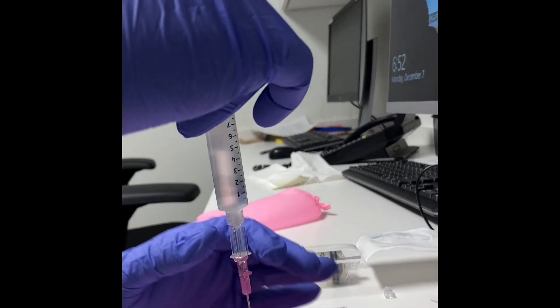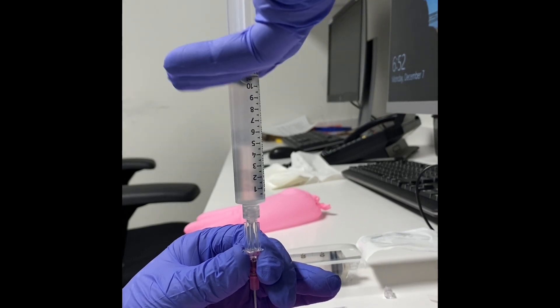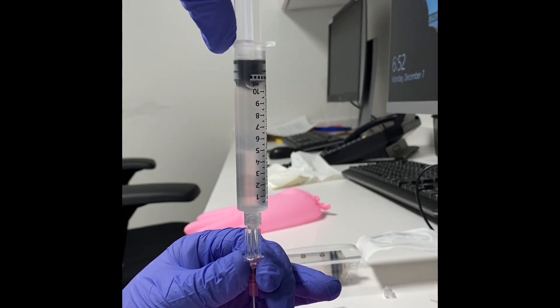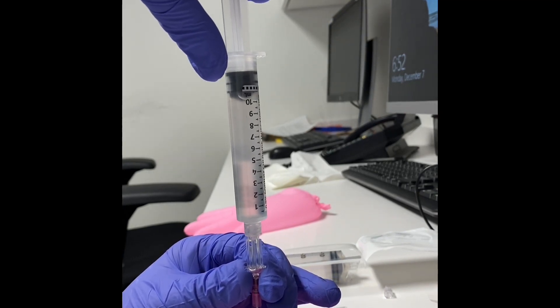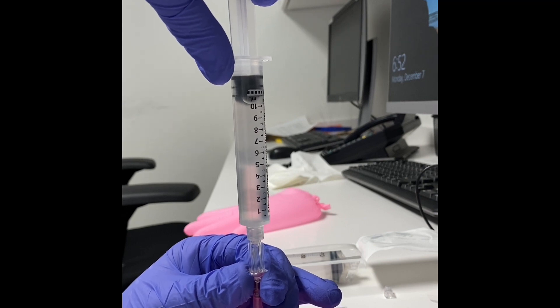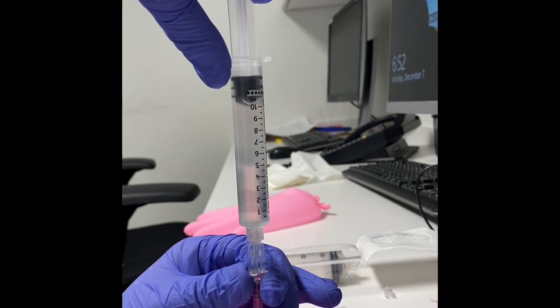Once the wheal is in, orient the catheter this way and start to inject to numb, then aspirate as you go. Inject and aspirate. You can usually feel the peritoneum right when you get above it. Once you get to that point, put a little more numbing medicine in and push through.